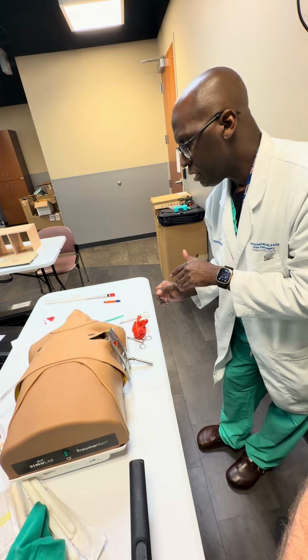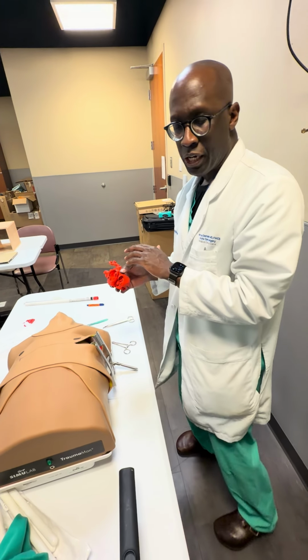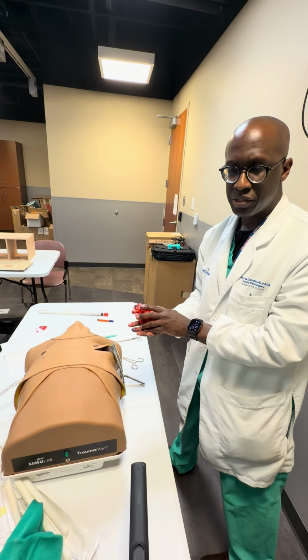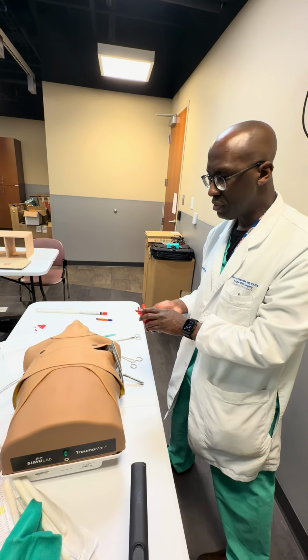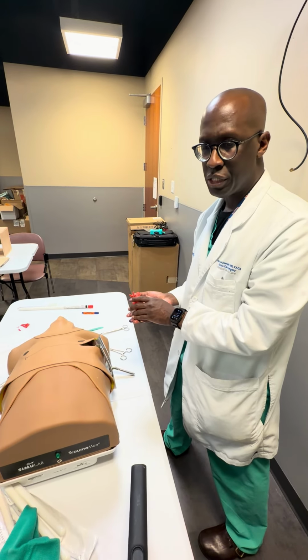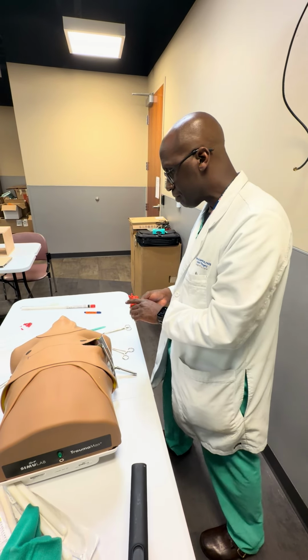At that point, if there's still no ROSC, I would convert to intracardiac massage, two-handed massage, just compressing the heart, simply to replace the CPR that you're doing. You can also use paddles as well, with the same sort of ratio that you would CPR, simply doing CPR, looking for shockable rhythms with your paddles.